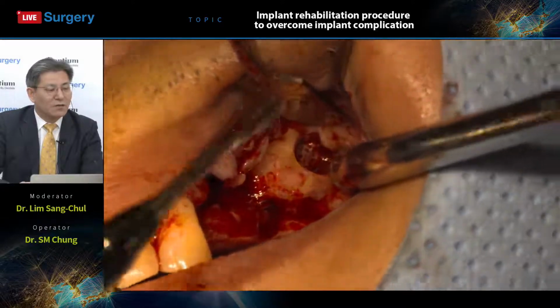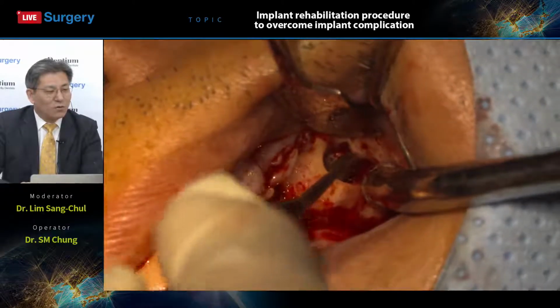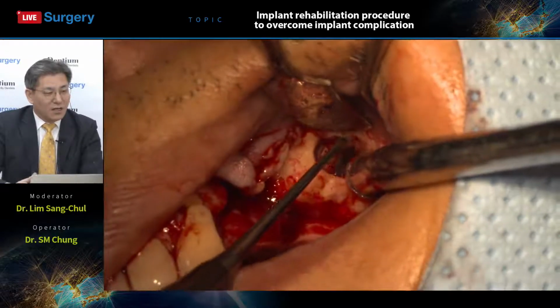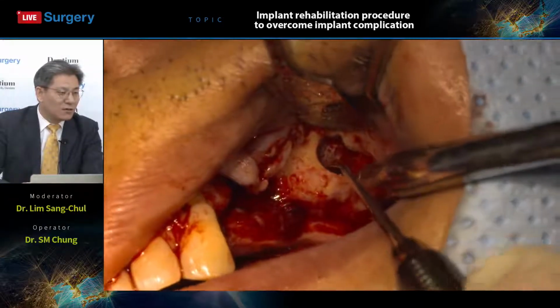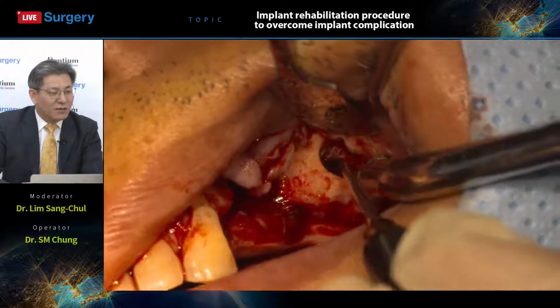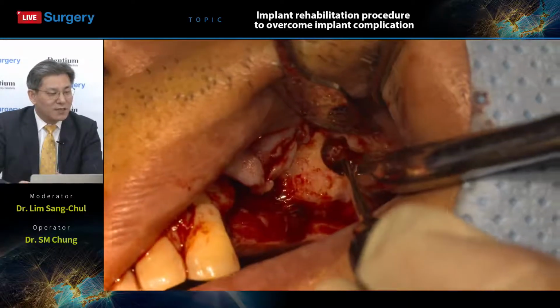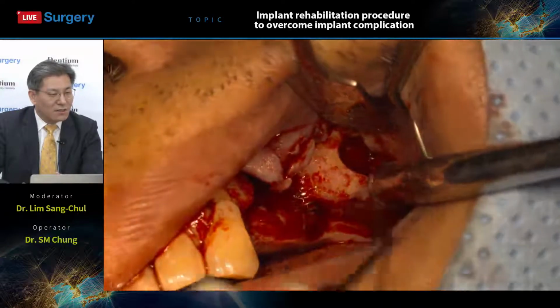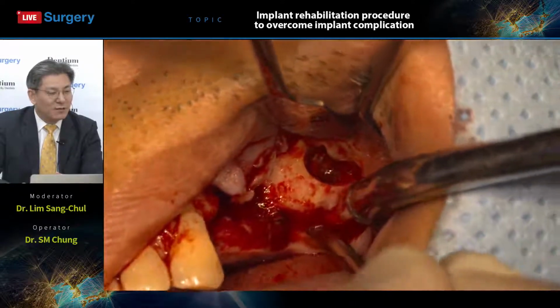Okay, so finally he is going to use the long bow. Long bow is another nickname of this kind of instrument. Oh, he can find the septum now around this area. Okay, he found the septum here with a tactile sense. So detachment is already done, a much faster membrane detachment from the lateral wall.